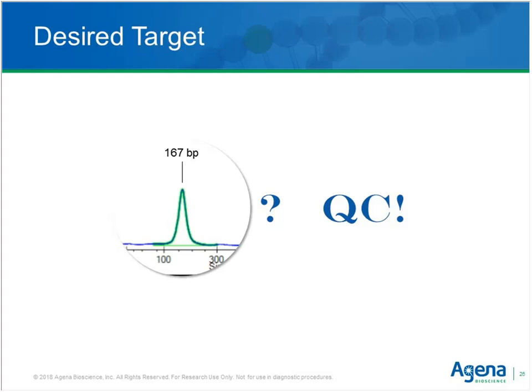Probably not, because that's something that cannot be repeated, as we said. Probably the result of a blood draw that you cannot easily get. Well, drawing blood can be repeated, but certainly not of that status or of that very sample. So it is advisable certainly to think about quality control of your sample, of your cfDNA sample.